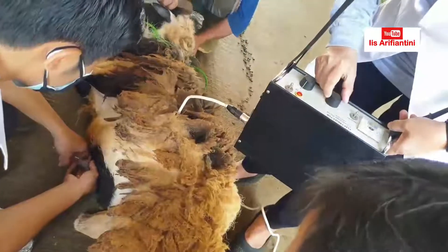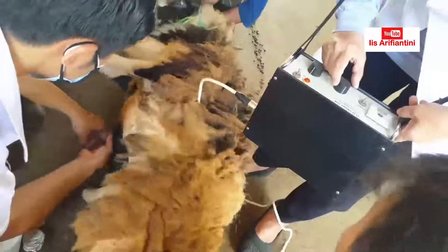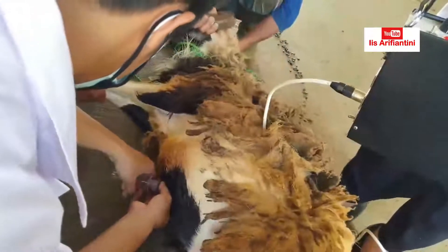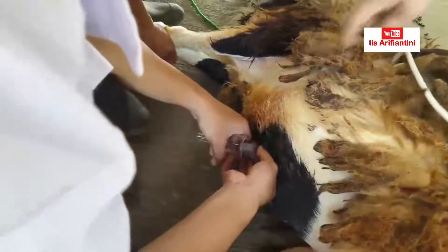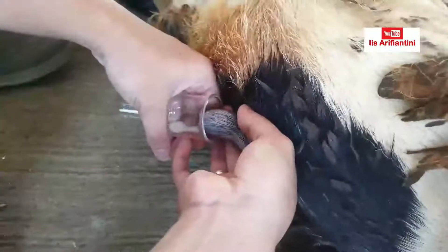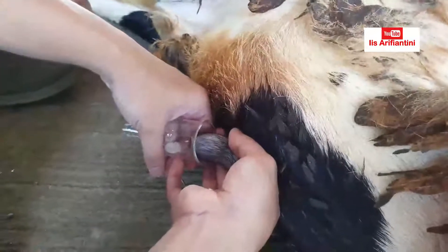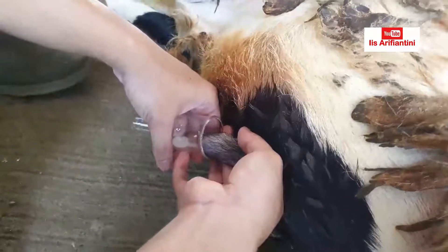Baru ada kedutan. Oke, turun lagi. Kita naikkan rangsangan, naikkan lagi voltasenya. 5 detik, kita turunkan lagi. Ini kita naikkan jadi 5. Fokus di tabung penampung — di 5, sudah keluar! Kalau sudah keluar di voltase 5, maka voltase yang diberikan tetap di 5, tidak boleh dinaikkan kembali. Jadi dibalikkan ke 5, kemudian diturunkan kembali, naikkan ke 5, turunkan kembali — dinaikkan berulang-ulang. Kemudian kita cek berapa volumenya.